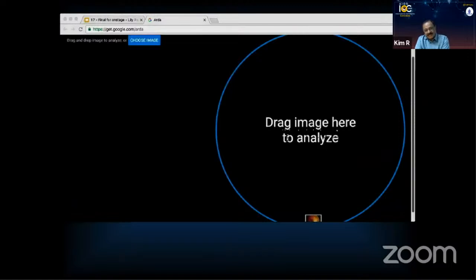So, who should do this screening? Unfortunately, today it's limited to ophthalmologists, while the target population is diabetics with the physicians and endocrinologists. I've been talking about the endocrinologists and the primary care physicians taking the onus of screening, and it should not be with the ophthalmologist. Unfortunately, only 1.3% of the general practitioners actually use direct ophthalmoscopes in one study because they don't have time, lack awareness, and of course lack training.